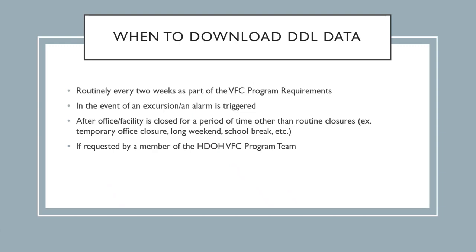For example, your office is closed for a long weekend, there's a school break, or your office took a day off that wasn't anticipated. You may also be asked to download your DDL data by a member of the Hawaii Department of Health VFC program team, so that's also a possibility. Next slide, please.